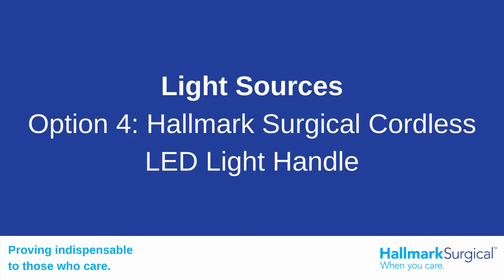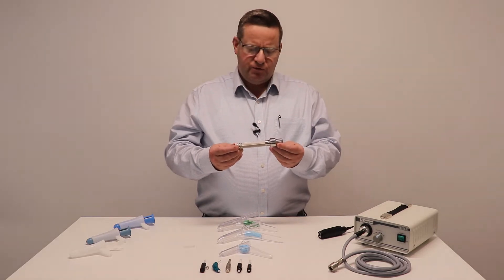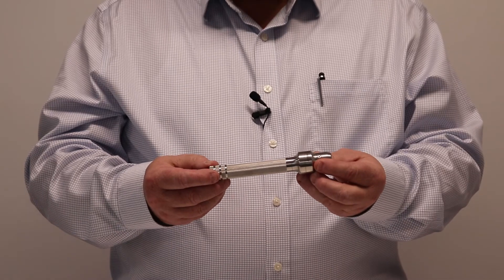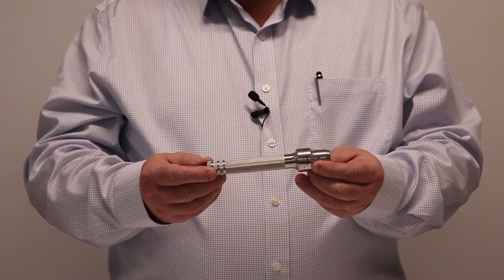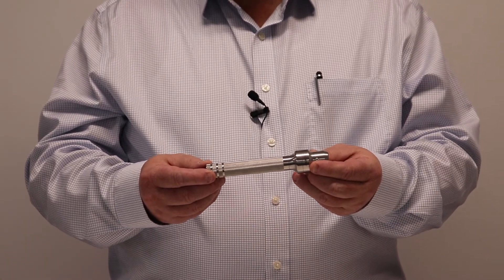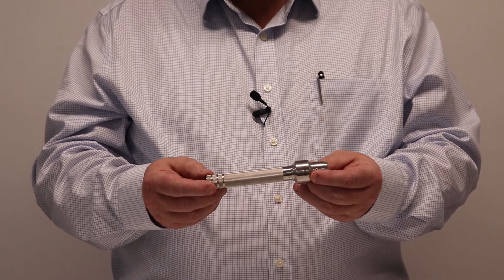The latest option — and very successful and popular — is this device here. The main advantages are the full stainless steel housing, which means it can be sanitized, soaked, and autoclaved. This housing can be put through a sterilization system.